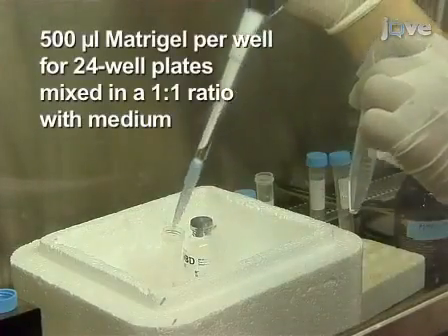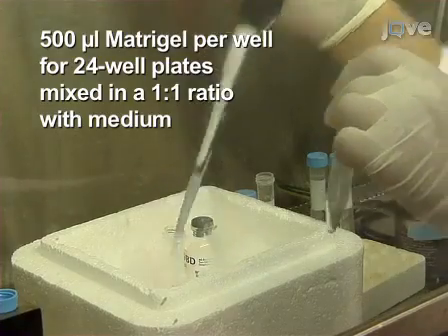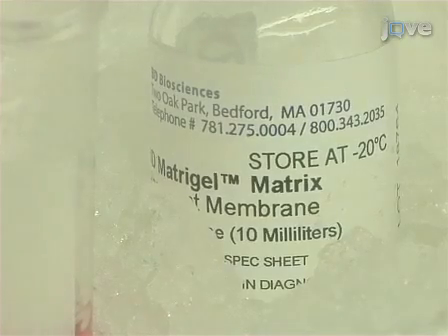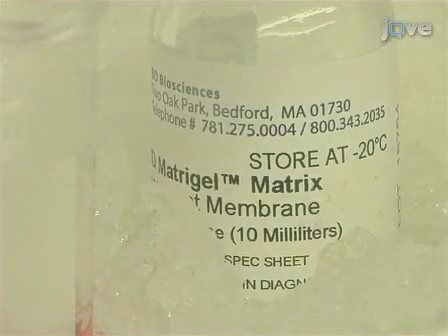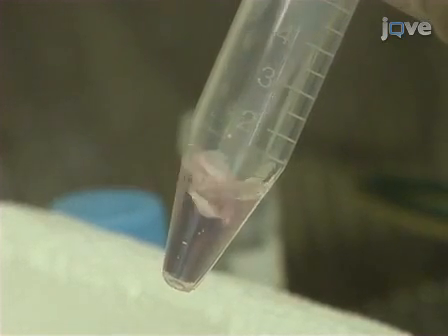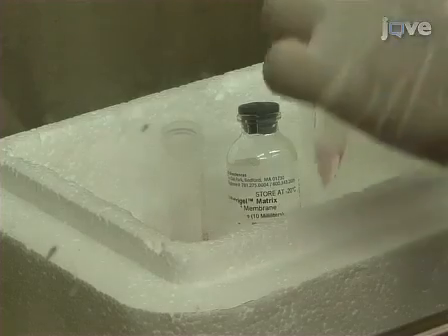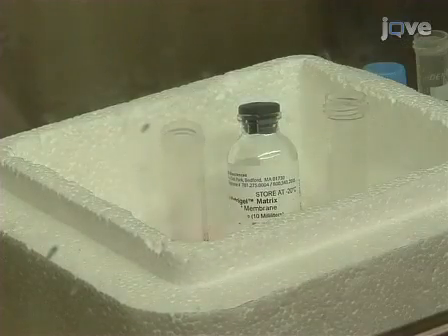To dilute the thawed matrigel, add half the volume of ice-cold HMAC medium necessary for the co-culture to a sterile tube on ice. Then, add the same half total volume of thawed matrigel to the tube to achieve a 1:1 dilution, keeping the tube on ice.